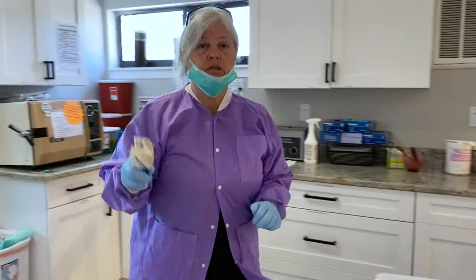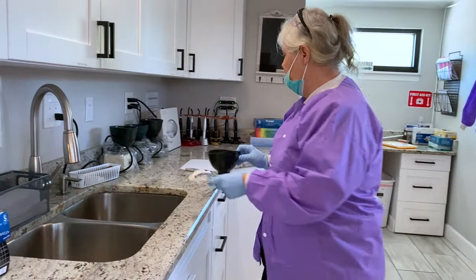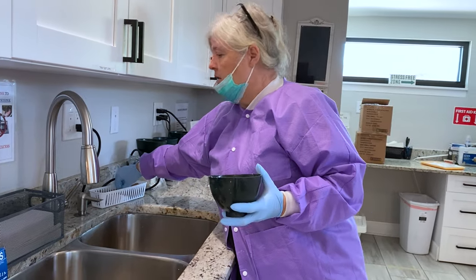Get your alginate, which is the negative impression, and we're going to make it into a positive. When you're pouring up, you're going to want to add the water very slowly.